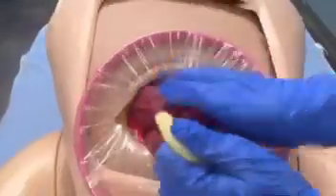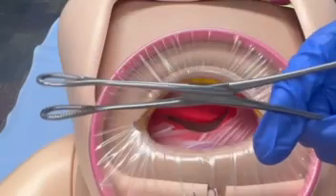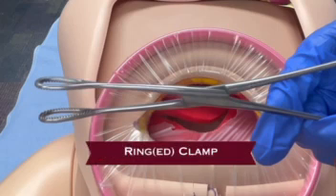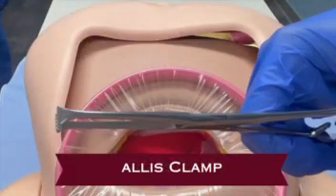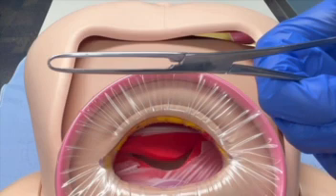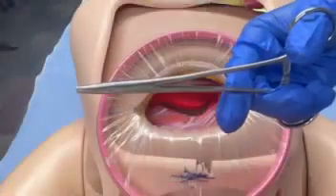After delivery of the placenta and removal of any clots or debris, closure of the hysterotomy begins. To provide retraction or aid with hemostasis, the uterine incision can be grasped with the ring clamp, which has large circular jaws with transverse grooves ideal for broad, flat surfaces, or with an Allis clamp, which has a wide, heavy tip containing multiple interlocking teeth. The Allis clamp allows for firm, secure tissue grasping, while its thin grip minimizes crush trauma to the tissue.